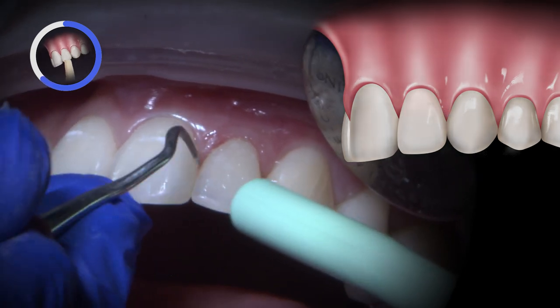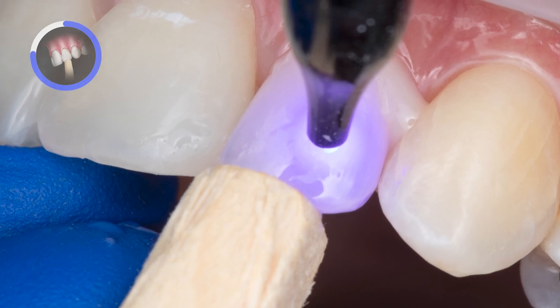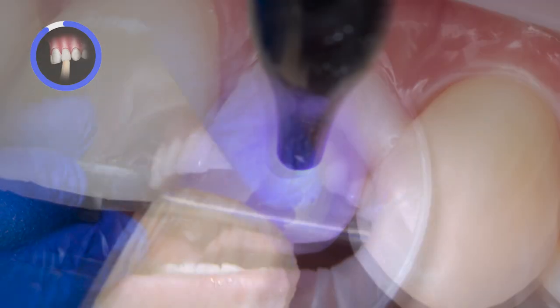Make sure not to fully cure until the inner proximal areas are cleaned well. Once satisfied, make sure to light-cure each surface for 10 seconds to complete the process.